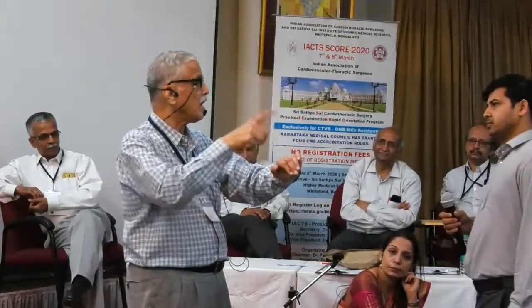So where is this middle cardiac vein? Very gently lift the RV and look at the main accompanying vein. It is distended, red in color, when cardioplegia is going. Any retrograde cardioplegia through the RA, not through the coronary sinus. What are the pros and cons?